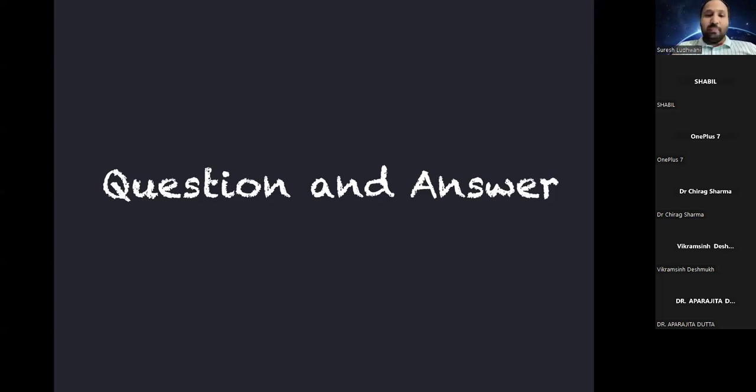Second is basal implants. Now for basal implants you need to consider also the length of the soft tissue, because only the abutment comes out. So while you are calculating the length, it is from the collar till the apex of the implant. So you have to calculate that entire length. Whatever length I told you from the second molar region, tuberosity and so on, add the soft tissue length to it, and that is the length which you are supposed to go for with basal implants.